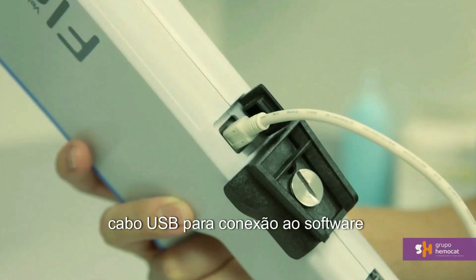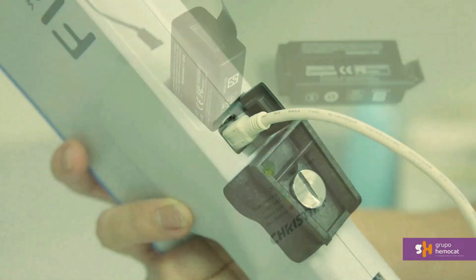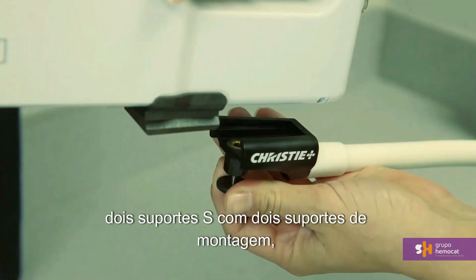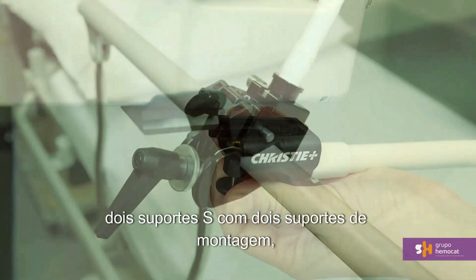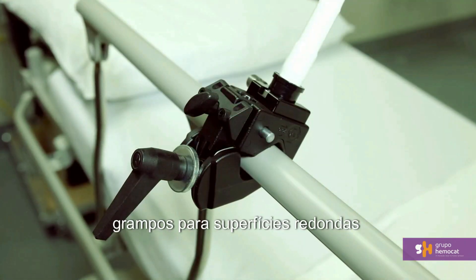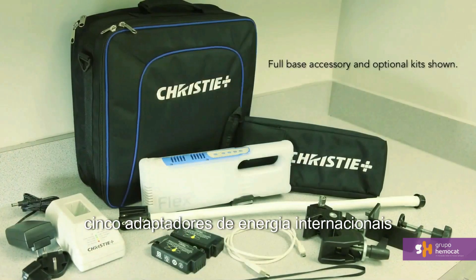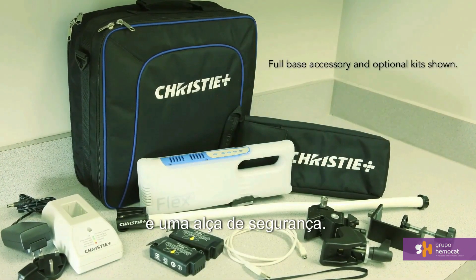The base accessory kit comes equipped with a nylon storage case, USB cable for connecting to the application software, two batteries, a battery charger, two S-mounts with two mounting brackets, the super clamp for round or square surfaces, the C-clamp for deeper or beveled edges, five international power adapters, and a wrist strap.